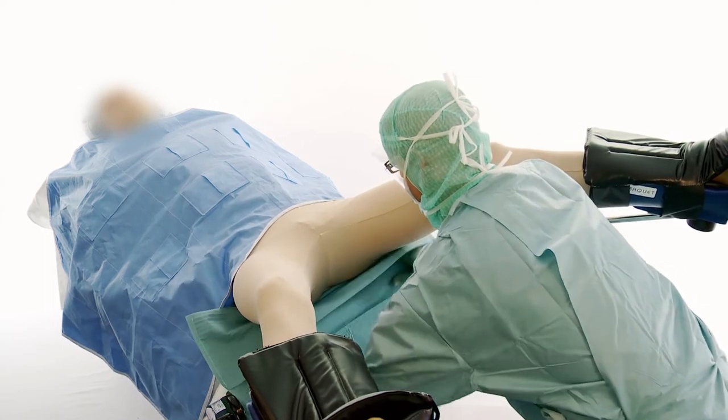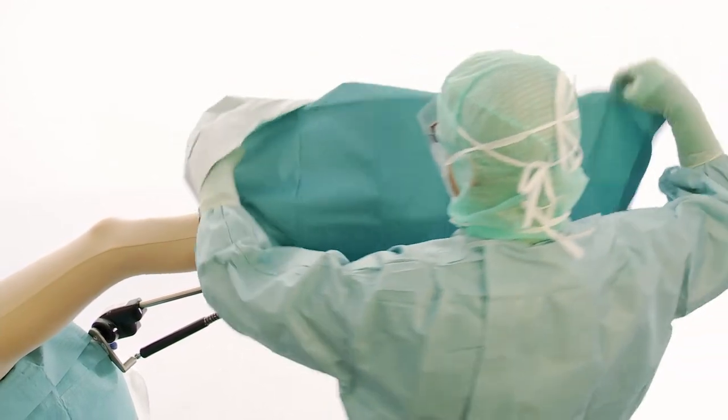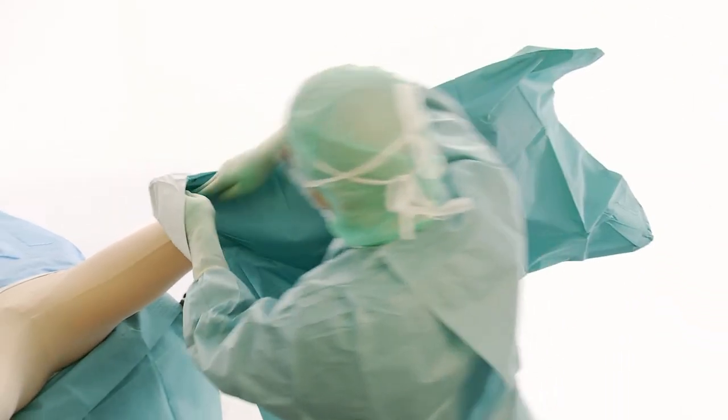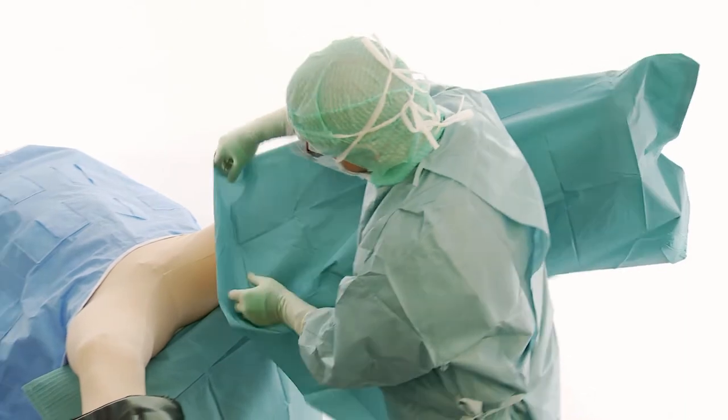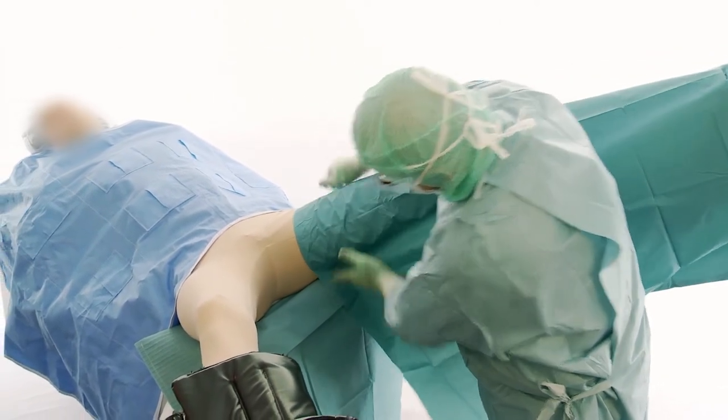Place your hands into the fold of the Lithotomy legging and fold all the way over the leg. Do the same for the other leg.